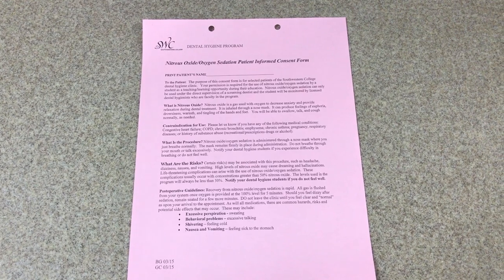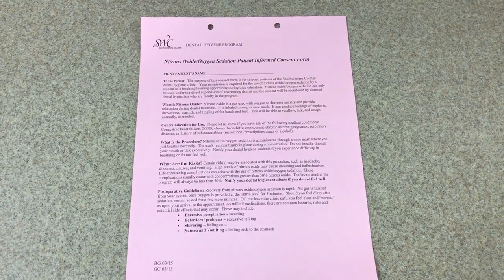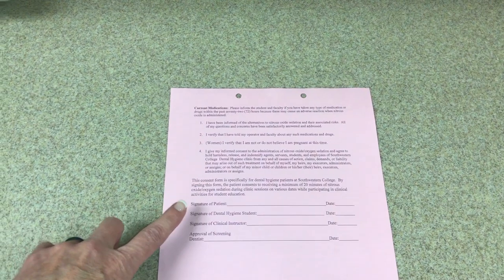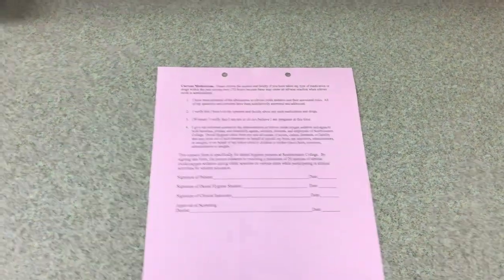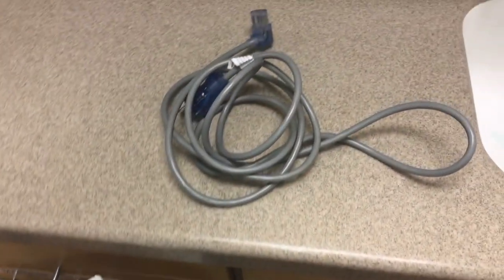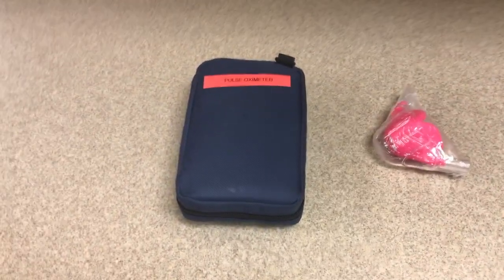Once you have completed medical history, vitals, and determined that there are no contraindications for nitrous oxide, you will retrieve the nitrous oxide informed consent, have the patient read and sign it, as well as the clinician, the faculty member, and the dentist. Once this is fully filled out, you may take this form to retrieve the other supplies you will need. That will include, if you are using a digital unit, a power cord; an analog unit does not require a power cord. You will also need a nasal hood and a pulse oximeter.